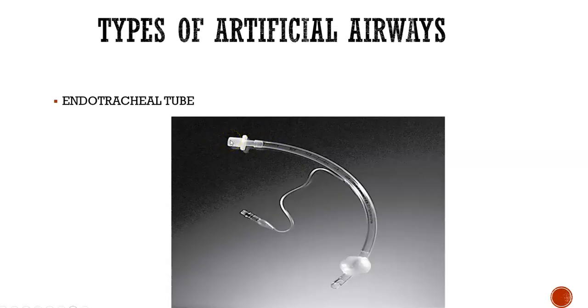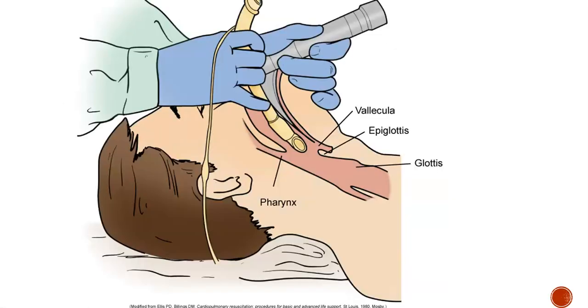And a lot of the times there's what's called inline suction, which will be hooked to the vent and it comes out straight, whereas the vent, like breathing tube, airway tube, goes kind of to the side. That will come straight out, and there's a line that you push and it goes all the way down, and you basically just pull it back, and there's a little button you press and it suctions and clears their airway out. Once we do ICU rotations this summer, I'll show you guys, because I'm sure that we'll have vents and stuff.